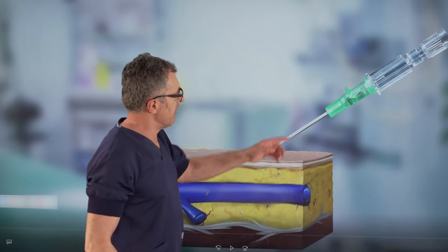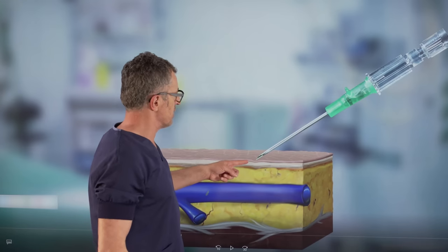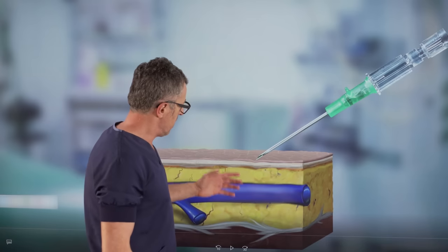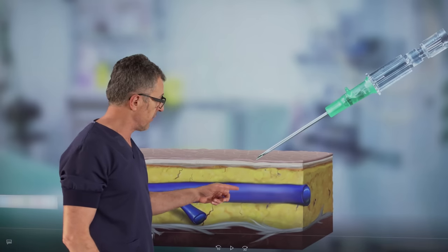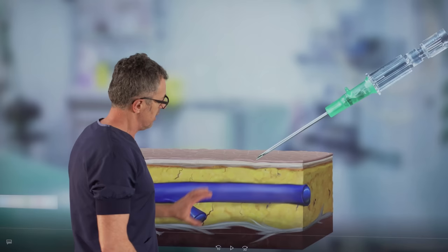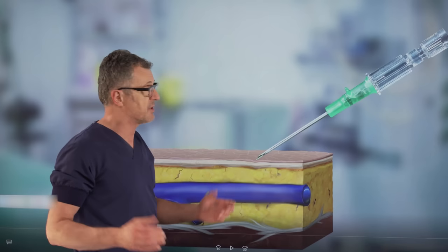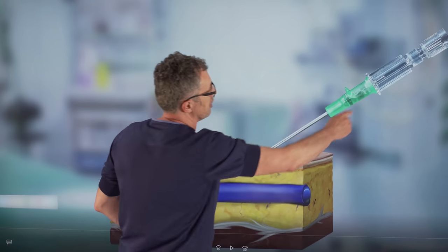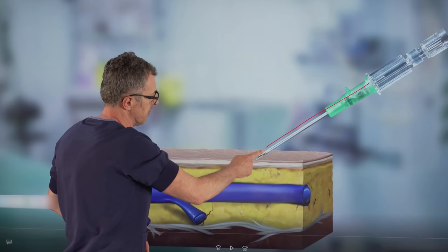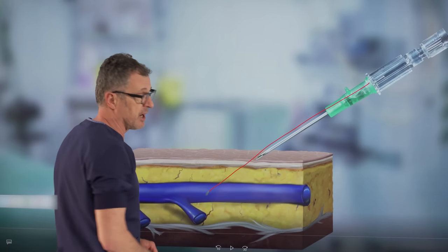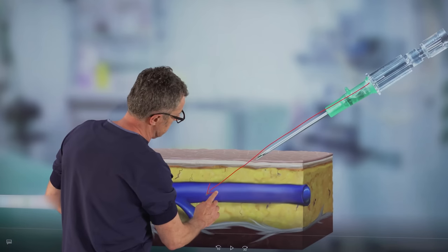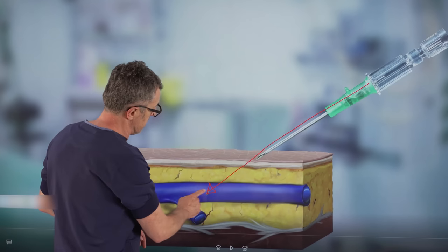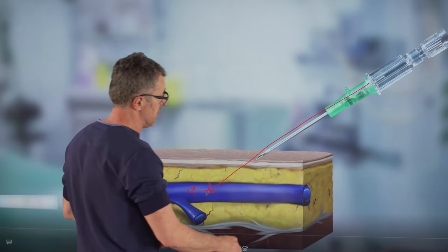So what we have here is the catheter over the needle system or an IV. We have a sample of the tissue with a peripheral vein underneath the dermis settled in the subcutaneous tissue. Typically, you would like to place your needle with the catheter into the vein.